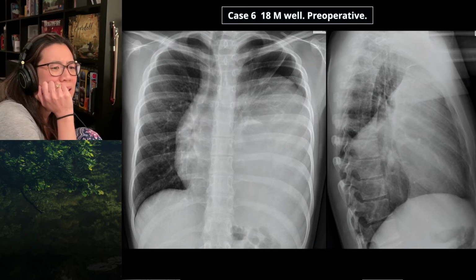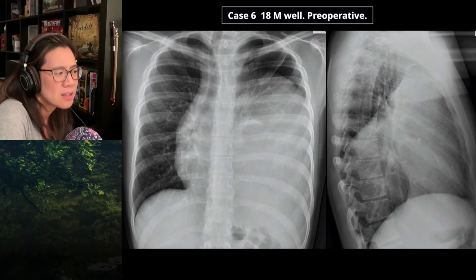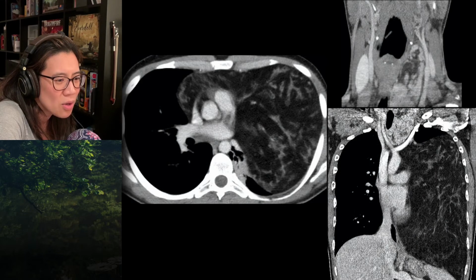It's hard to be certain, but look how well you can see the left posterior ribs compared to the right ribs behind the liver. Yes. And so it's a well-penetrated, skinny bloke, and you can see it, but it's one of those things when you get a fat-containing mass. You haven't actually said, but I assume you've worked out that it looks like fat on the X-ray. Yeah.